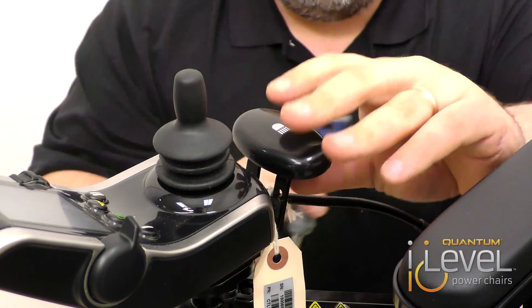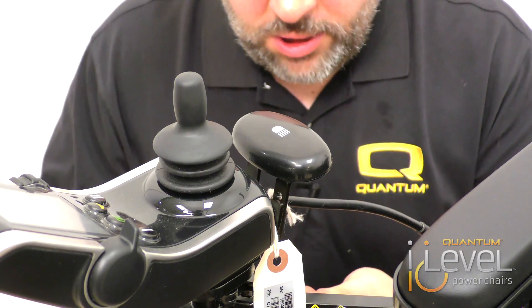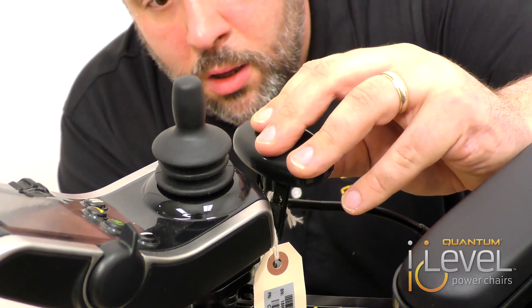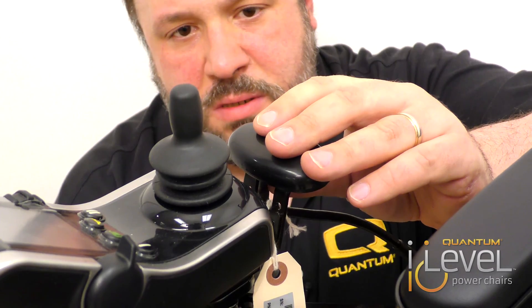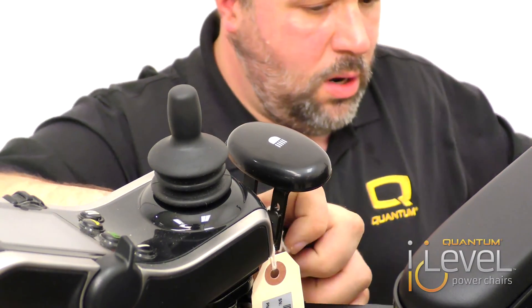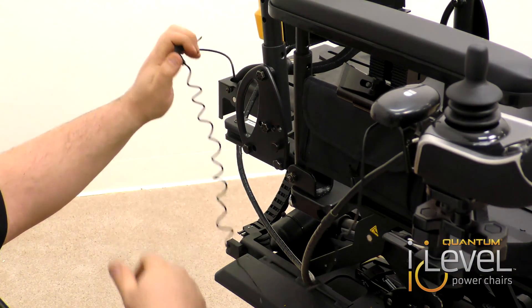We're going to use the screws that come with it to attach it right to the four-button actuator bracket. Make sure everything is nice and tight. Then you run your wire — in this case, we're going to run our wire right along the joystick wire. Then you just plug this right in.